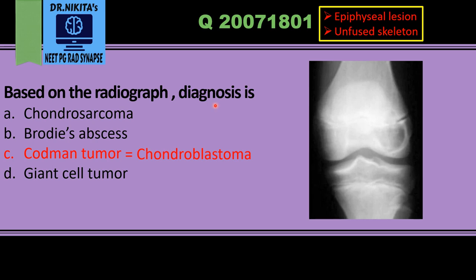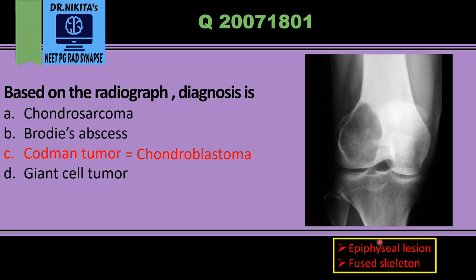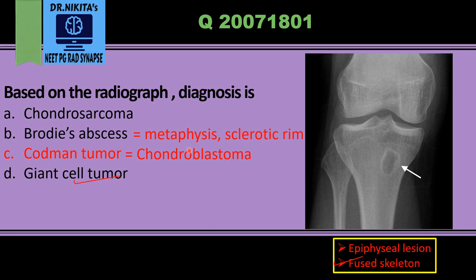If we see an epiphysis lesion in a fused skeleton — as shown here, where the lytic lesion is in the epiphysis region but the physeal plate is closed and the epiphysis and metaphysis are fused — it is a giant cell tumor. So the key difference: chondroblastoma is an epiphysis lesion in an unfused skeleton, while giant cell tumor is an epiphysis lesion in a fused skeleton.